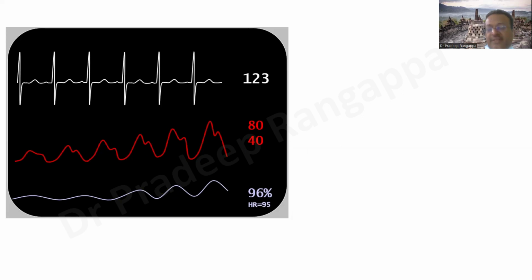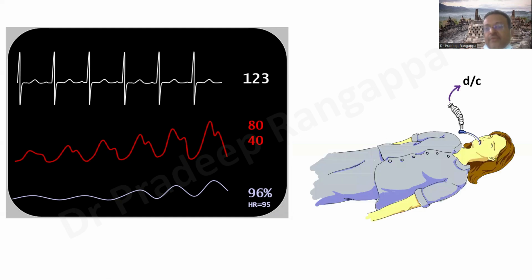So all in all, in these COPD patients, when you connect them to ventilator, they tend to have hemodynamic compromise or blood pressure tends to come down. Why does this happen? Because in patients where your alveoli are already bloating and the pressure in the chest is so high, your venous return decreases.